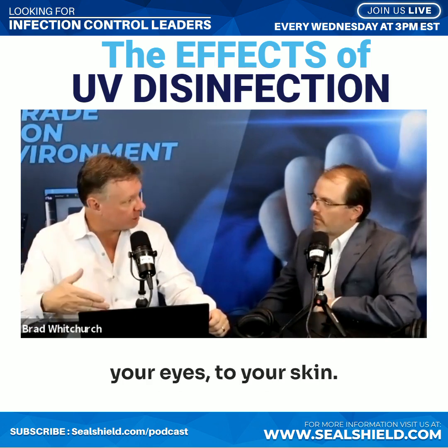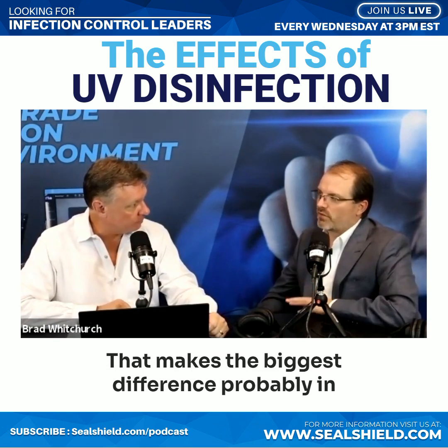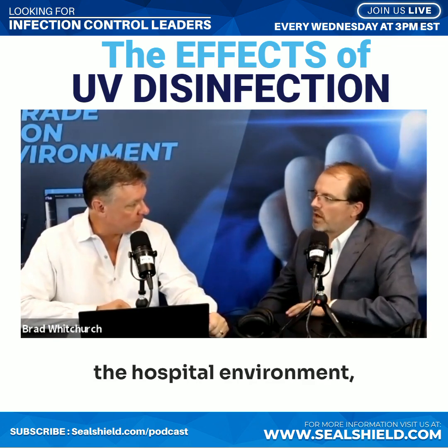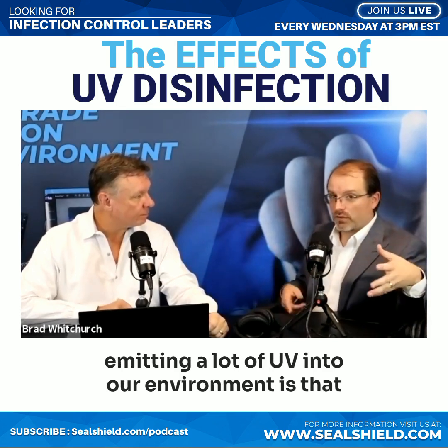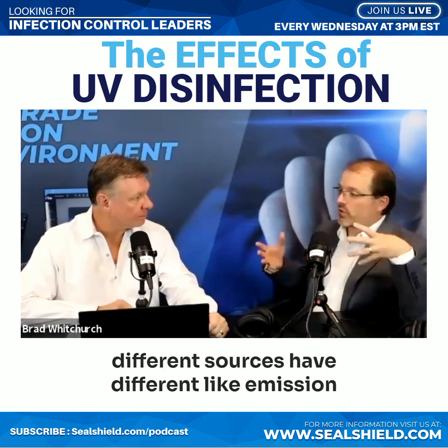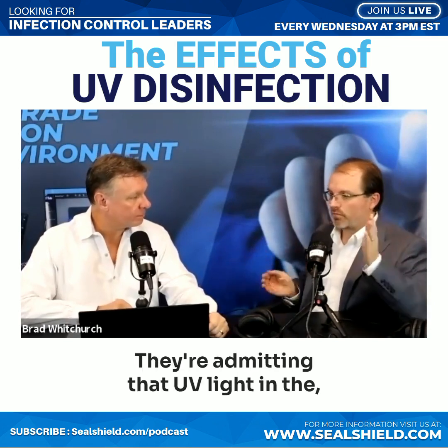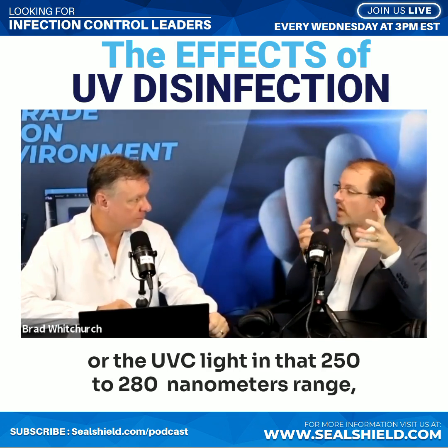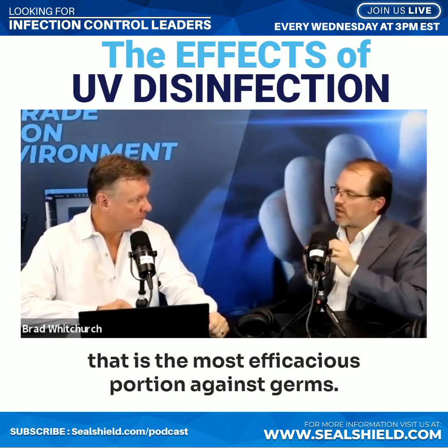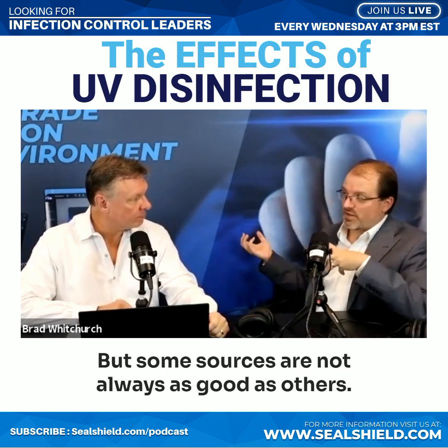to your skin. Oh yeah, and there's actually one other risk too that probably makes the biggest difference in the hospital environment. When we're emitting a lot of UV into our environment, different sources have different emission profiles, if you will. They're emitting that UVC light in the 250 to 280 nanometer range that is the most efficacious portion against germs. But some sources are not always as good as others.